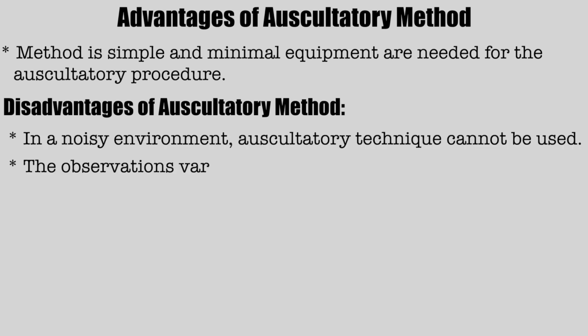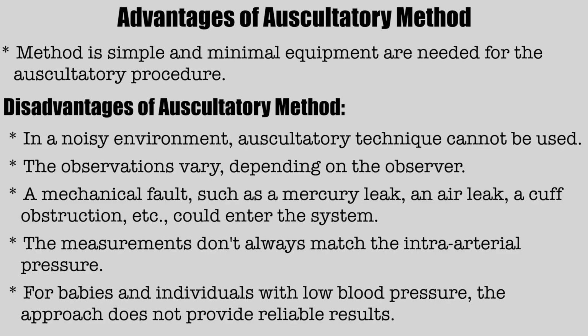Now coming to the advantages of the auscultatory method. This method is simple and minimal equipment is needed for the auscultatory procedure. Now we see the disadvantages of the auscultatory method. In a noisy environment, the auscultatory technique cannot be used.